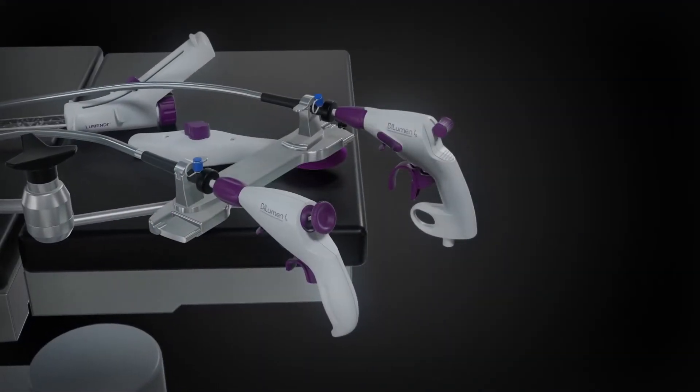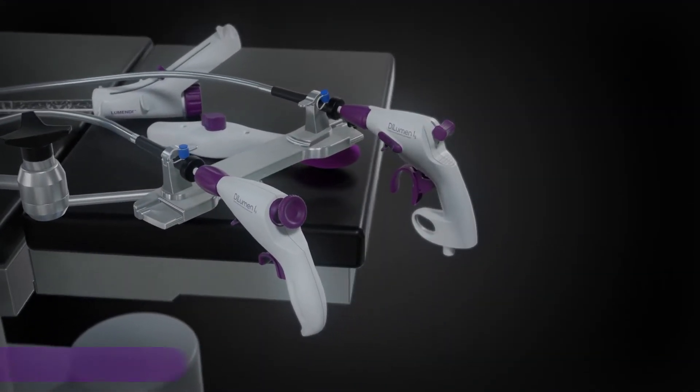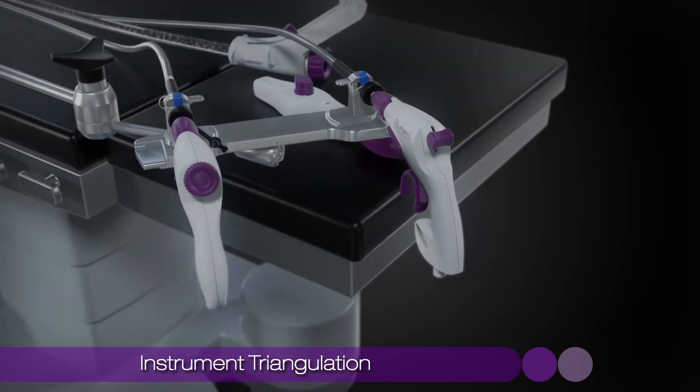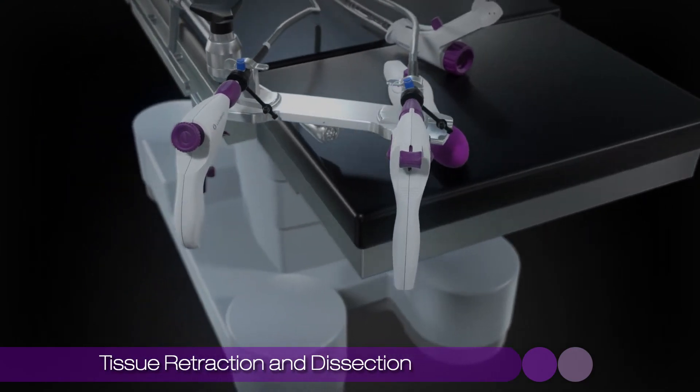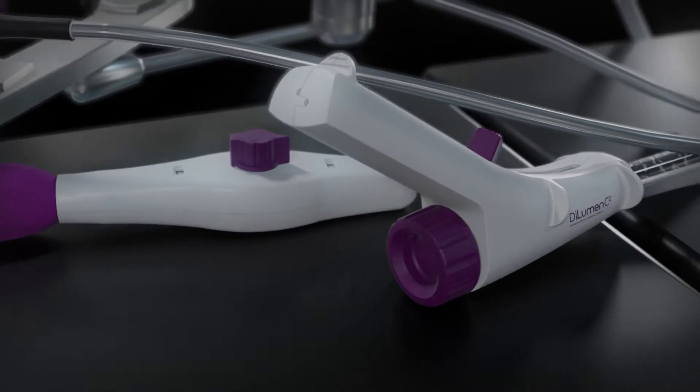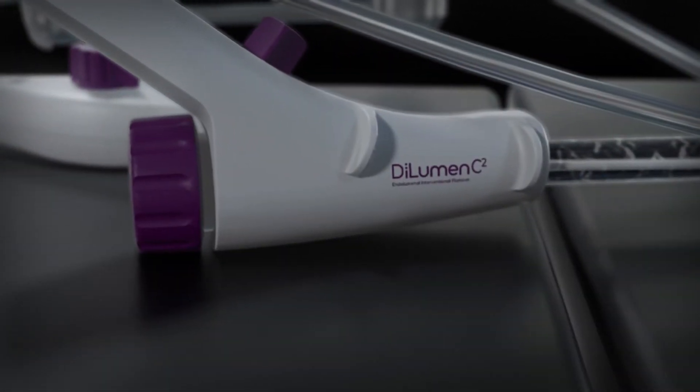After several years of development, Lumendi has successfully merged the principles of laparoscopic surgery, instrument triangulation, tissue retraction, and dissection with the benefits of flexible endoscopy. This new evolution in patient care is called Dilumen C2.